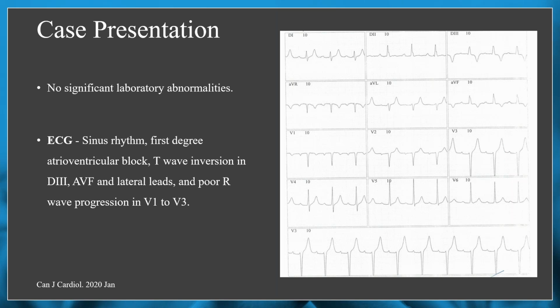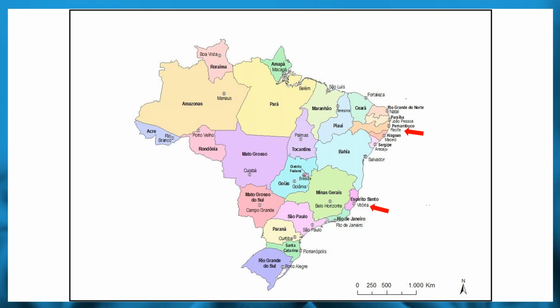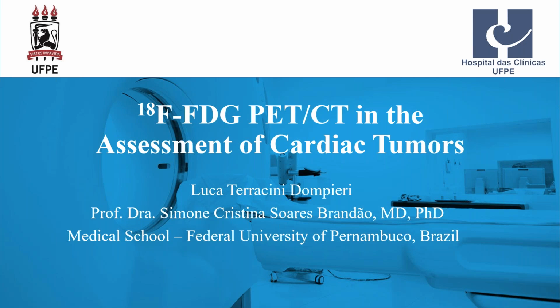Simone, is there any influence of systemic clinical conditions like diabetes, hyperlipemia, anything that could impact the results and the uptake of the contrast in this situation? It's an excellent question, Veronica. Luca spoke a little bit about it.